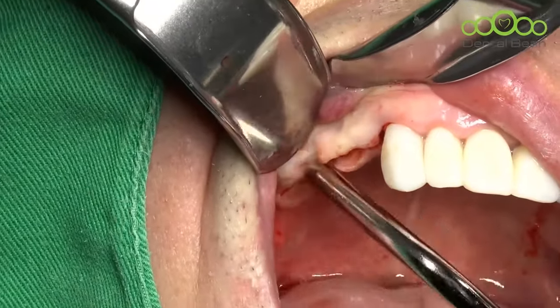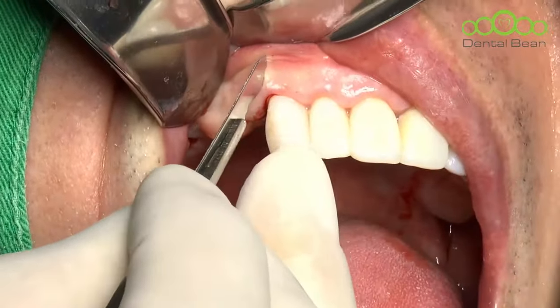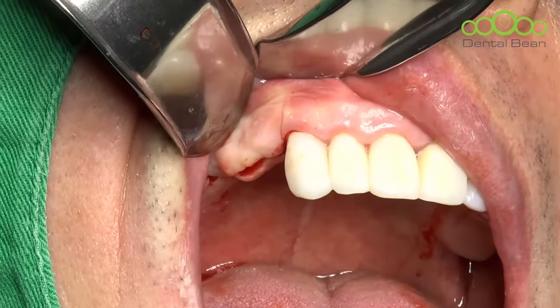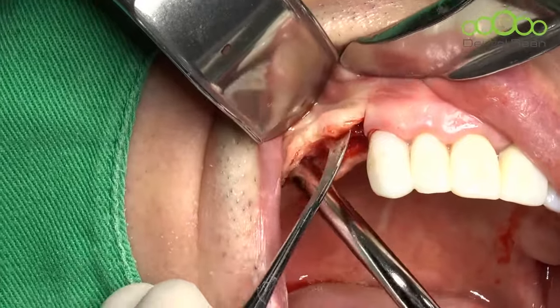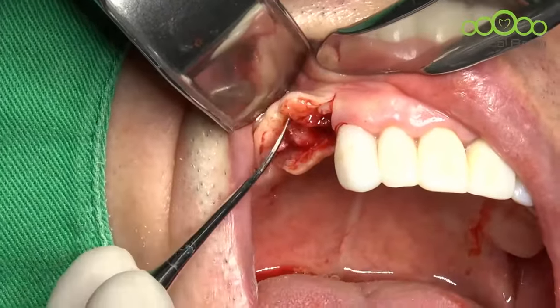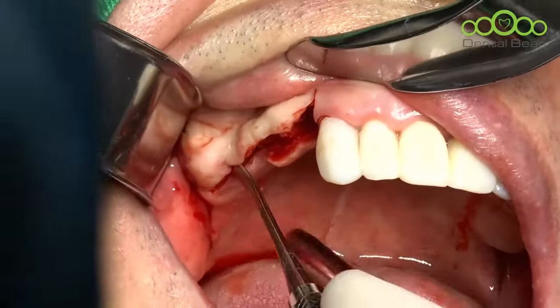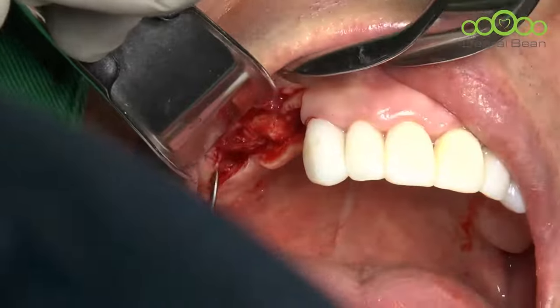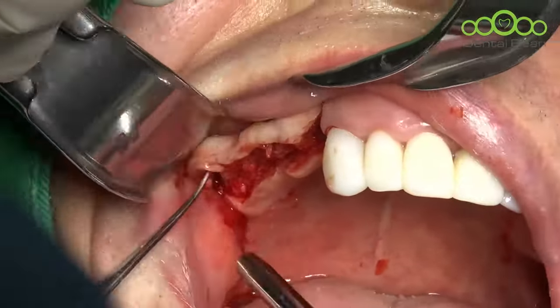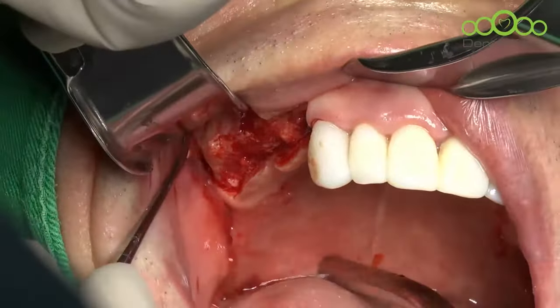Well, usually I don't give a vertical incision, but in this case, it is better to use a short vertical for good surgical access. Okay, I made a short vertical at the premolar site, and then less exposed. There's a chance to do a ridge split, so I will give a vertical incision and expose the ridge like this. Okay, good.